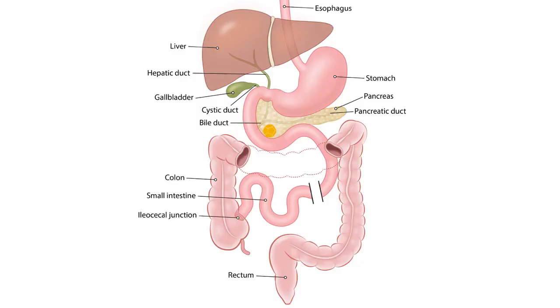So, let us see. Here is a mass in the pancreas that you can see. So, you pass the linear EUS scope down the mouth, pharynx, esophagus, stomach and duodenum, and once you find a mass under ultrasound, the mass is located in the pancreatic head. So, you decide to biopsy, you pass a needle under ultrasound guidance and take tissue. That is how we use the linear EUS scope.